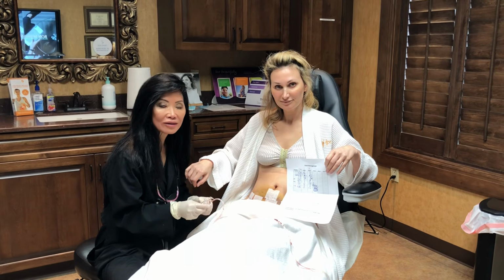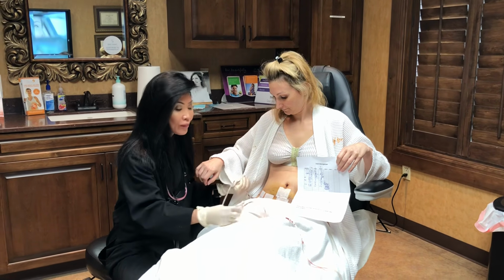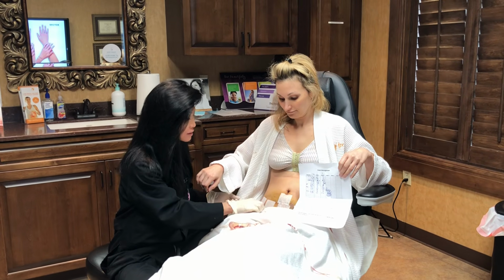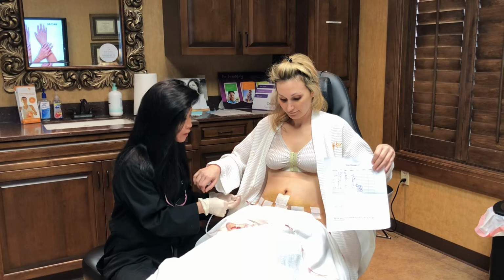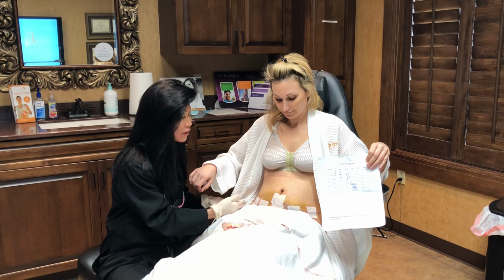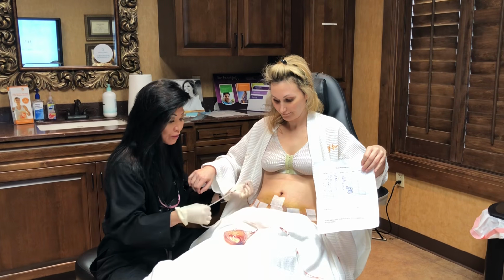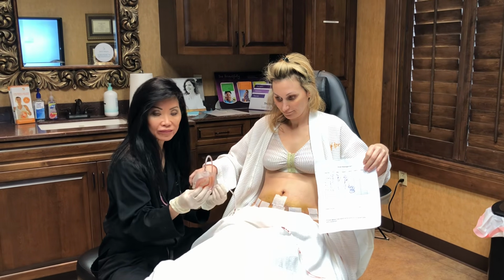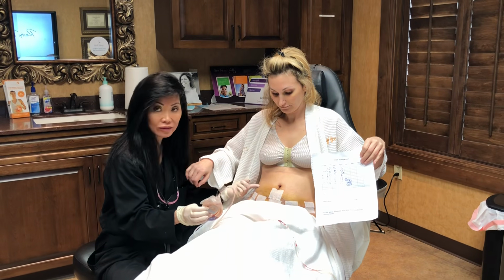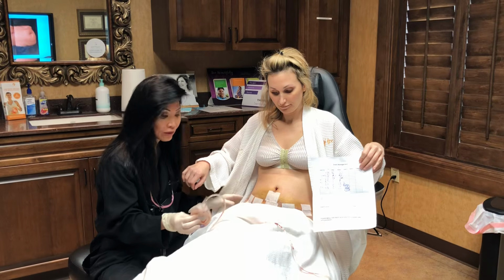Hello, we're going to talk about drain care. Crystal has had a tummy tuck, and when we put drains in, we put the drains in underneath the wound so they don't collect any blood or fluid, and then the patient will typically heal faster without a gathering of all the fluids. So when we have a drain, we have the drain tube, and then we have a bulb. And we are actually wanting the fluid to come from the tummy or wherever the drain is through the tube into the bulb so it will drain that fluid.